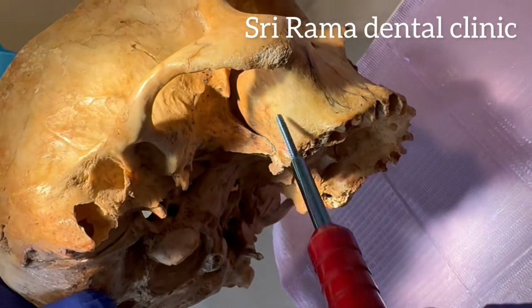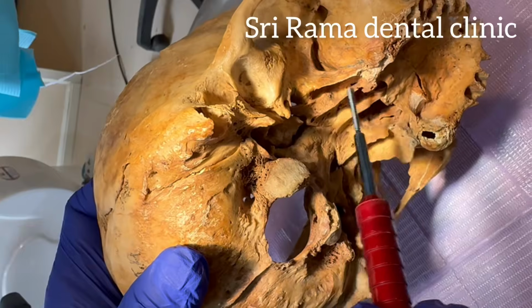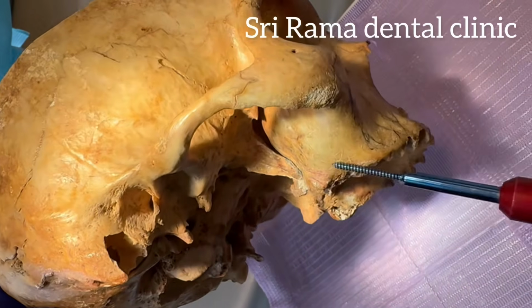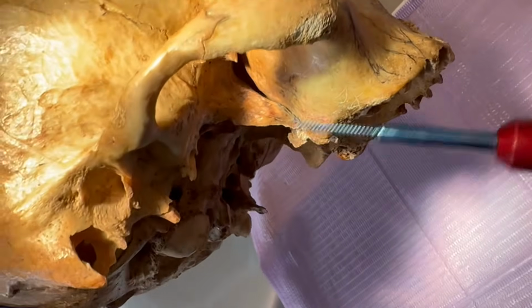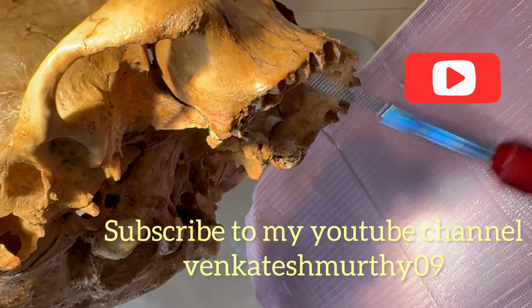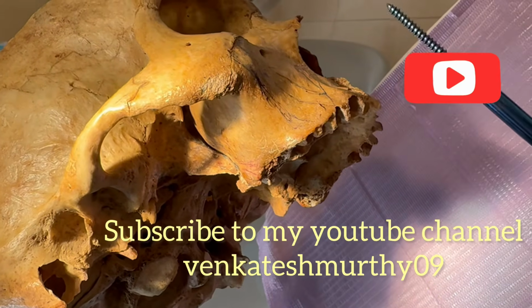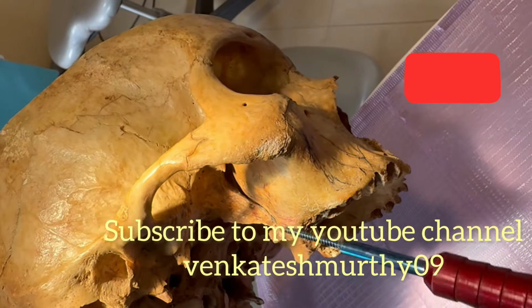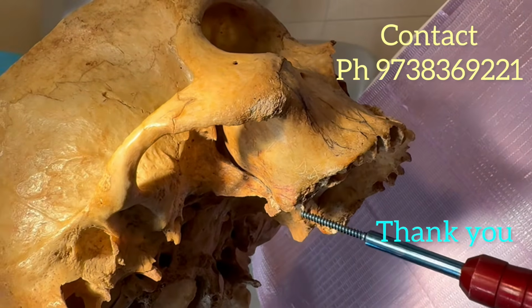So this is the anatomical structure important to place your pterygoid implant. This is the pterygoid fossa. This is the fissure and this is the fossa, and the implant should engage here. Okay, so you can place a single pterygoid or double pterygoid. So this will be the terminal anchorage in your full mouth rehabilitation case, where the advantage is that no sinus lift, no augmentation procedure related to the maxillary sinus, and then no cantilever effect. Since you have placed the last implant in the pterygoid region, you will get good stability from the last implant. That is the thing. Thank you.